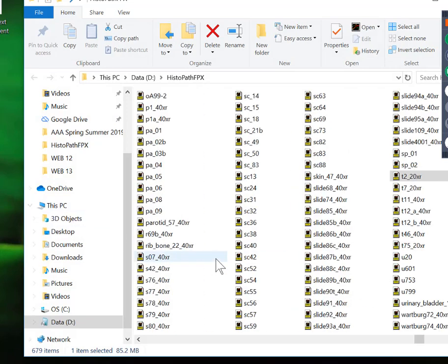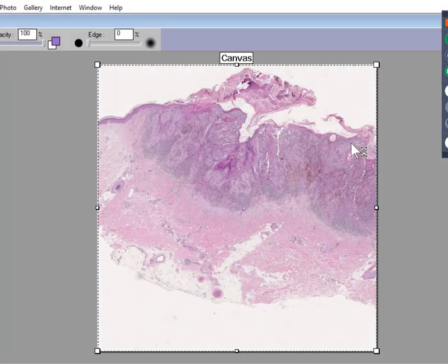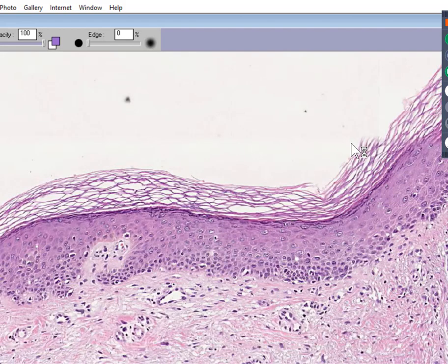So let's go back to the D's. Here's the D, here's the 13, and here's going to be another primary skin cancer. And of course now it's easier to tell that this is skin, because all the way on the left coast here, you could clearly see, at least in this little edge, this is normal skin, textbook normal skin. Stratum corneum, stratum granulosum, stratum spinosum, basal layer.